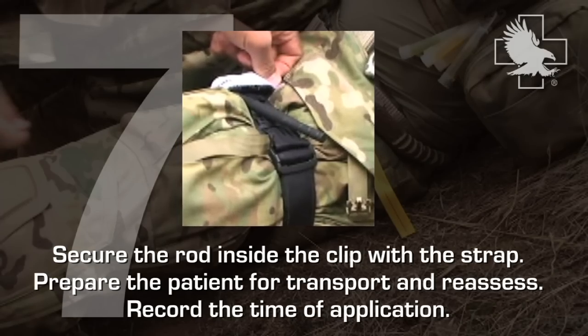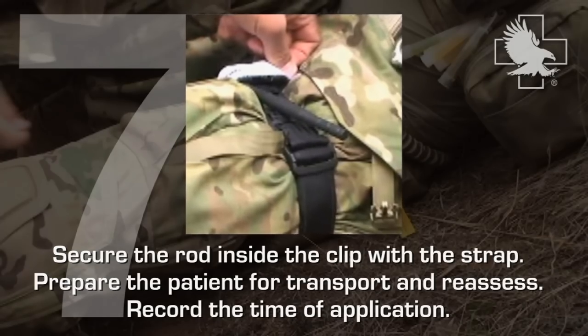Secure the rod inside the clip with the strap. Prepare the patient for transport and reassess. Record the time of application.